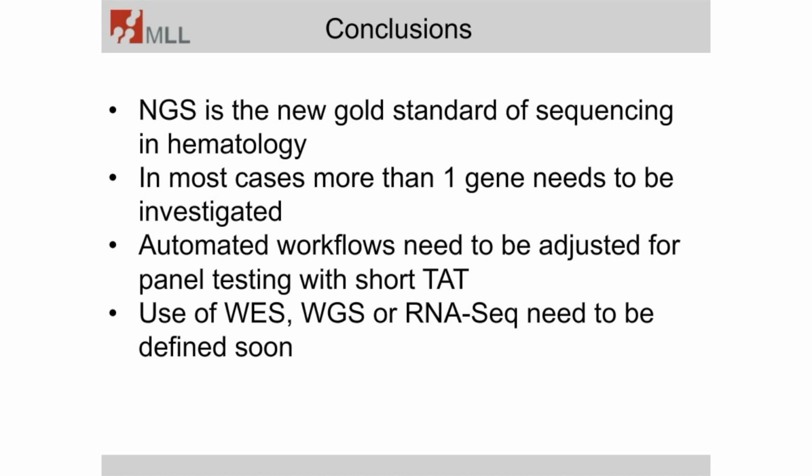The use of whole exome sequencing or whole genome sequencing combined with RNA-Seq needs to be defined, and what we are doing right now is to do a first approach to compare it with a routine diagnostic approach as state-of-the-art right now, and find the gaps, but also the needs and also the options of tools being NGS-based to be implemented, augmented by artificial intelligence approaches in the next years for diagnosis in leukemias and lymphomas.